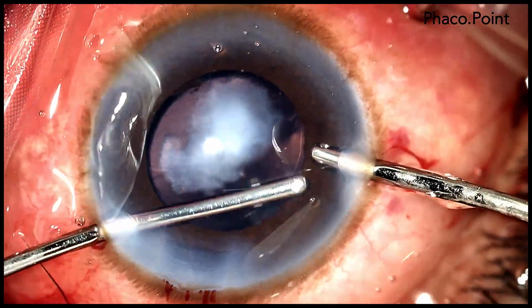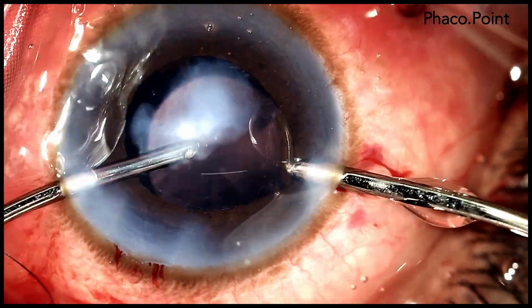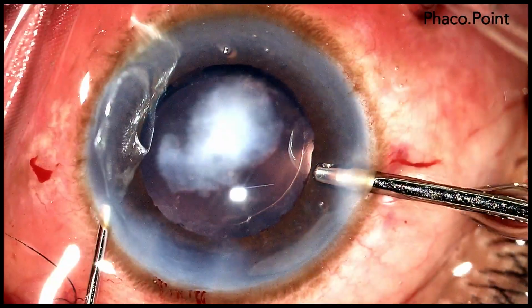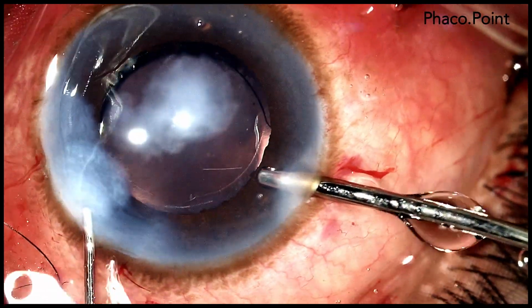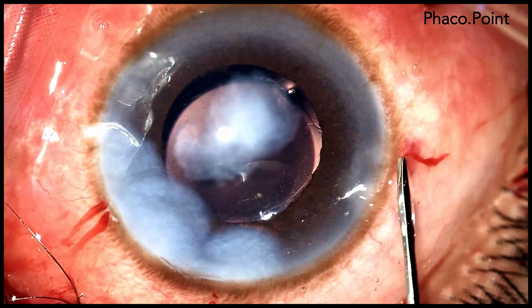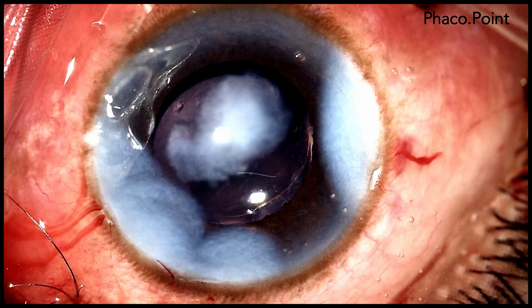which it is removed completely from the anterior chamber, and having done so while maintaining the irrigation in the eye, the incisions are hydrated. And finally, the irrigation probe is removed from the eye and the right paracentesis incision also hydrated. And this, as you can see, is the end result that we achieved.